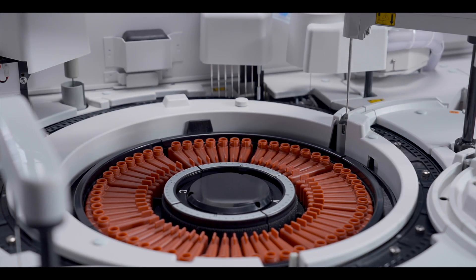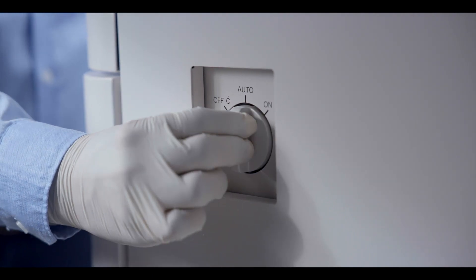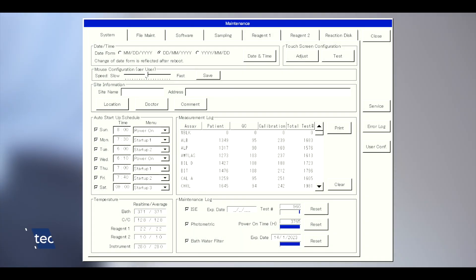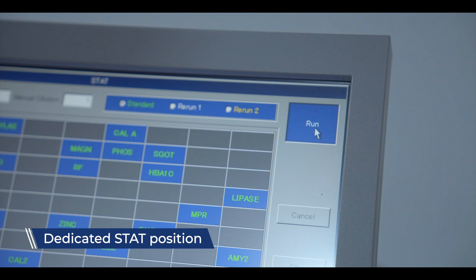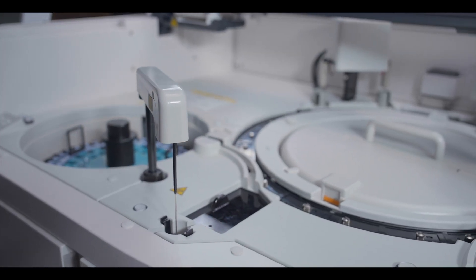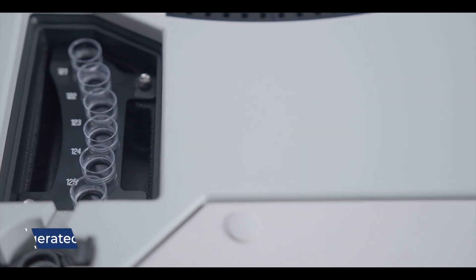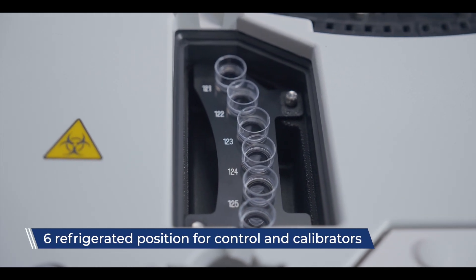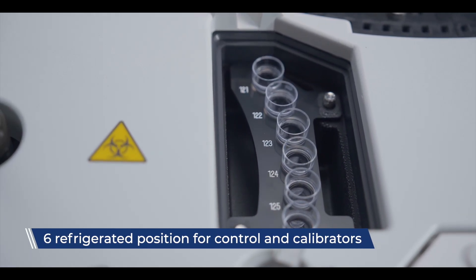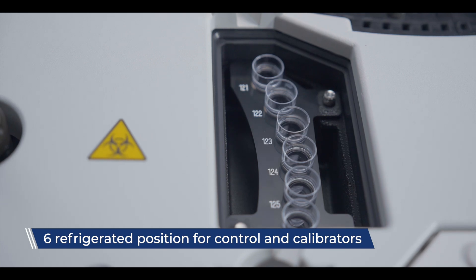Operating as a self-contained system, the TBA-120FR includes an auto-start function and a dedicated stat position, enabling rapid sampling in just 4.5 seconds. Additional six refrigeration positions at 2 to 8 degrees Celsius offer storage for controls and calibrators.